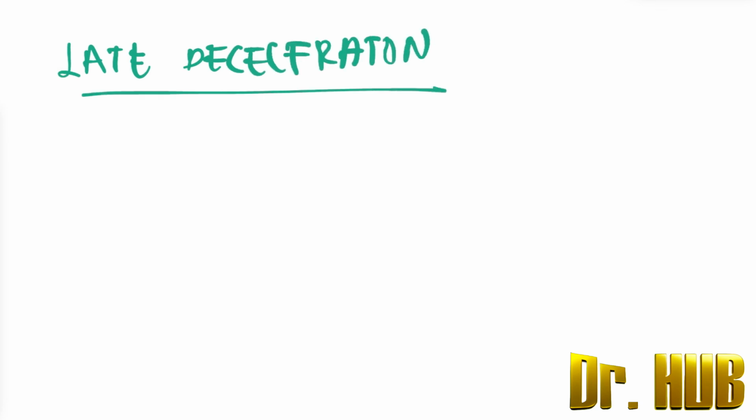Next, we have the late deceleration. So in the late deceleration, what do we have? So in terms of the late deceleration, it is seen in the uteroplacental insufficiency.